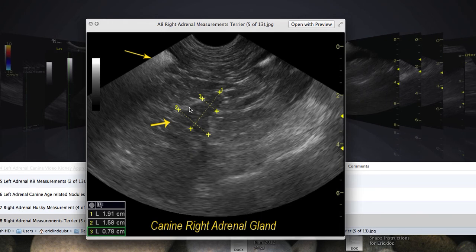If we look at a terrier, the adrenal looks more like an arrowhead — the cranial pole is much wider in the right adrenal gland. Scanning at two to four centimeters, we measure the cranial pole and the caudal pole. This area is frequently missed because the ascending and transverse colon is in the way, and this part of the right adrenal gland often sits under the rib cage. You really have to get in from a retrocostal or subcostal position, push gradually with spread-out pressure, and scan at two to three centimeters. Tumors in this cranial pole go right through the phrenic vein into the vena cava — a sneaky area where pathology hides while the caudal pole looks completely normal.